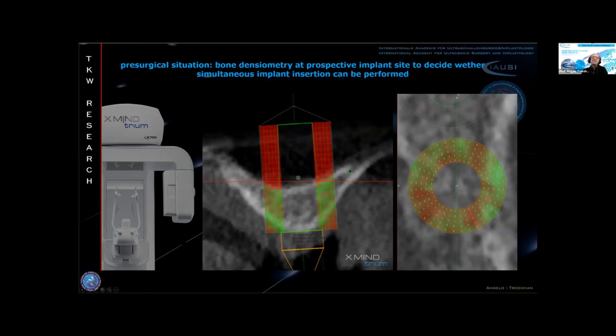No, you just take a simple look at the projection of the implant you want to insert, and you see if it's greenish or really highly green, there you have absolute perfect bone quality. You can see it here. Of course, you see it also by the gray tone value, that the compact bone here is highly green.